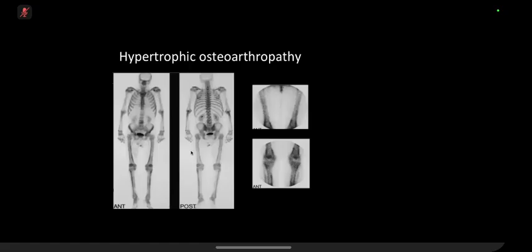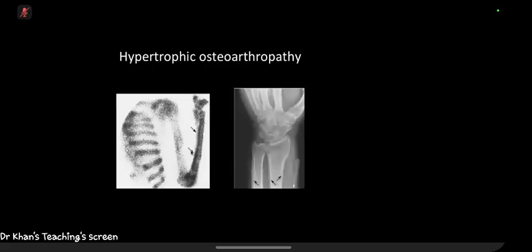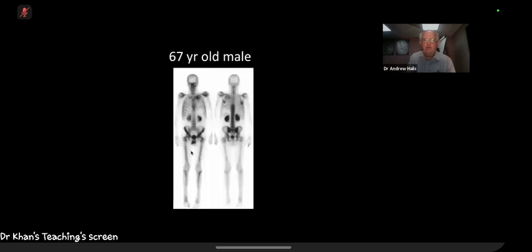Okay, Andrew, we have to go to the next candidate now. Thank you, candidate 2. Candidate 3 is with us. Thank you. Hello. Hi. Hello. I'll just move on. That's hypertrophic osteoarthropathy. Right.